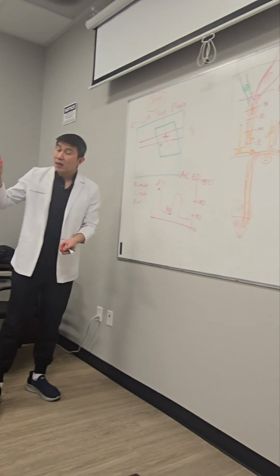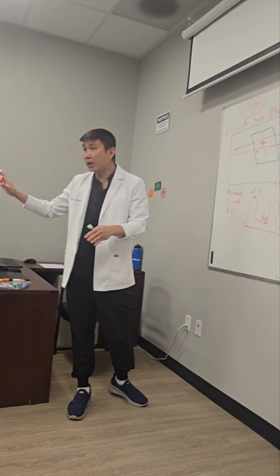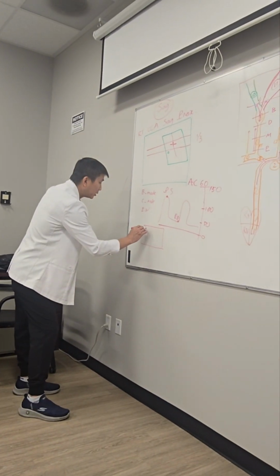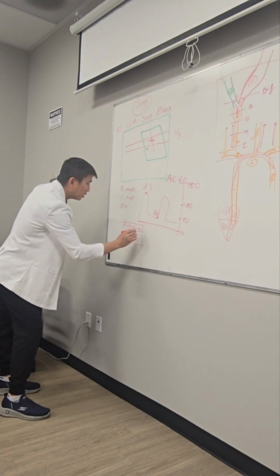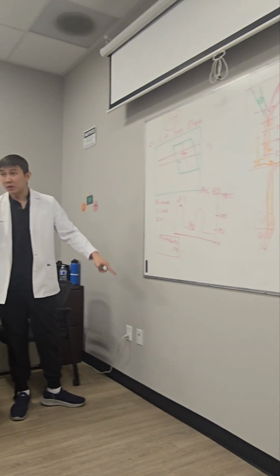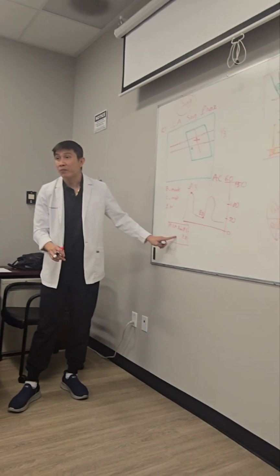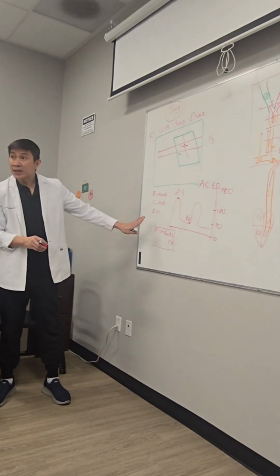Alright, so when you're good with the velocity, you can hit the measurement location. When you hit it, you're going to see the box right here. For example, we measure the right CCA sagittal proximal. You're going to see right CCA proximal, peak systolic number, and end diastolic number in the measurement box. So when you see these numbers, you're good, you can save. Because these numbers will go to the report. And with vascular, these numbers are the most important. The doctor will use these numbers to diagnose.